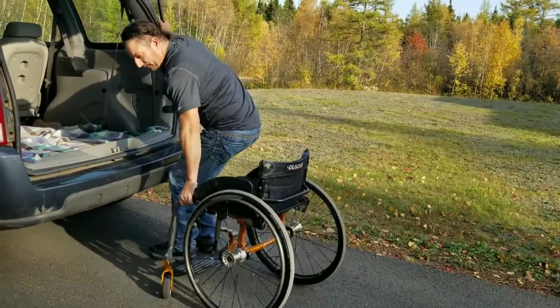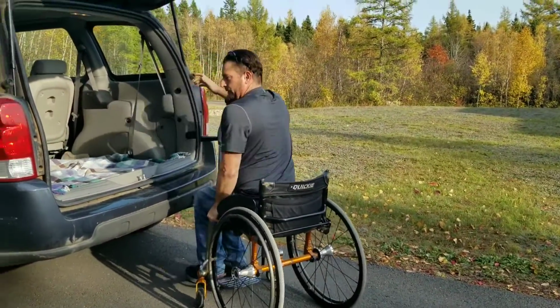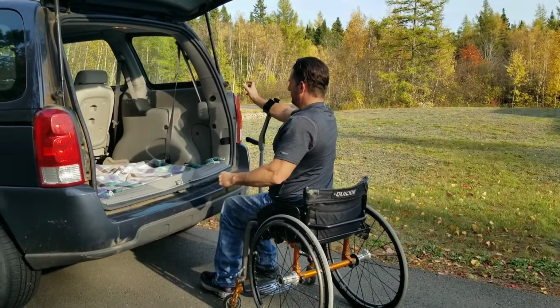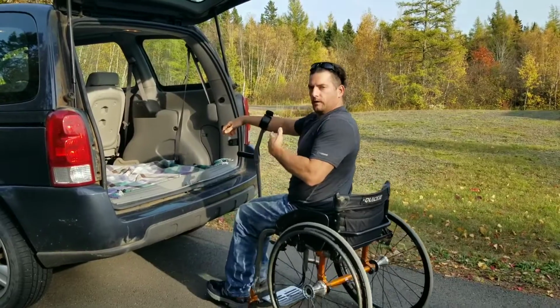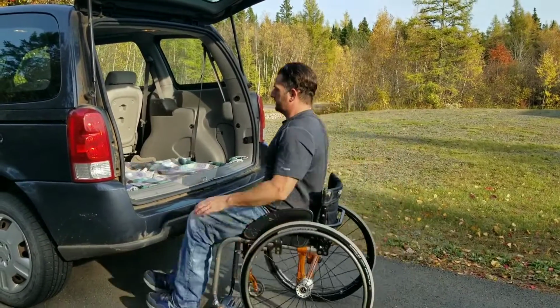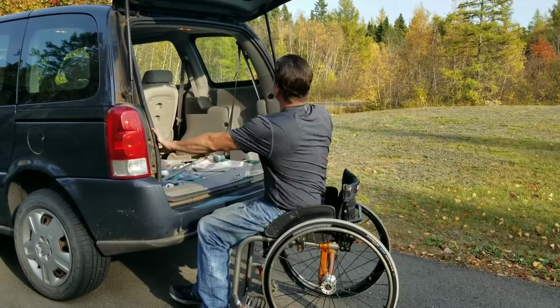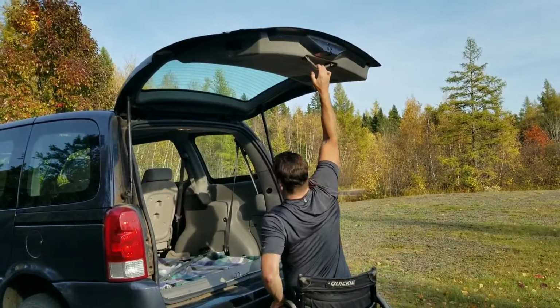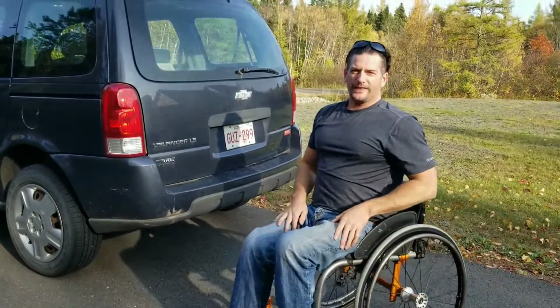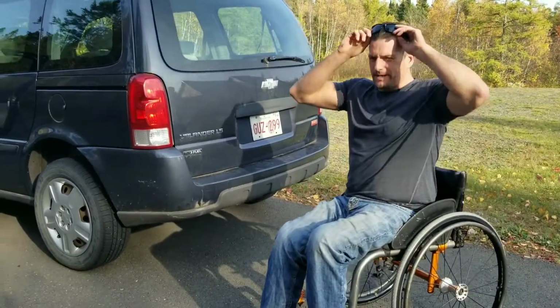You notice I'm always having a firm grip on something with one hand. When I'm grabbing the chair with the hand, I'm always having a firm grip on something on the van so I don't fall over. And then I put, whoops, and I put that right there. And so that's another way that I did for many years.